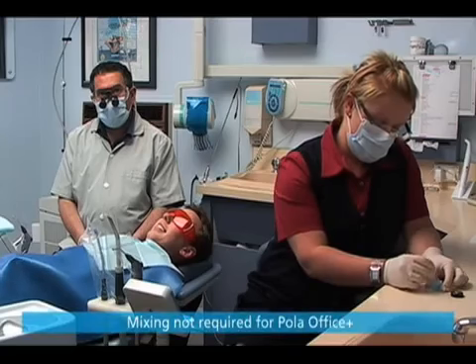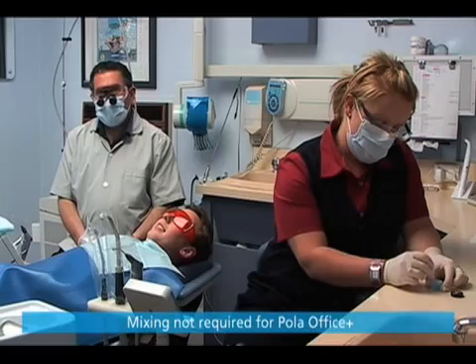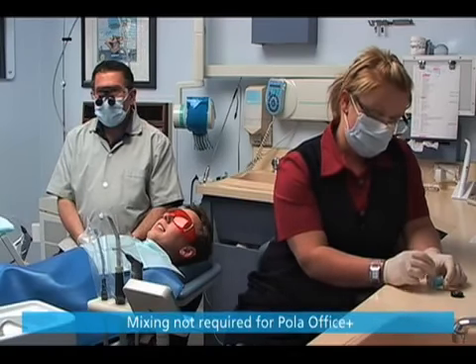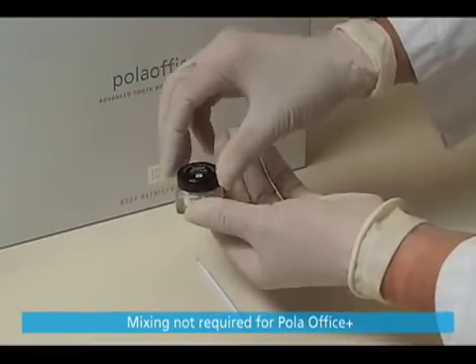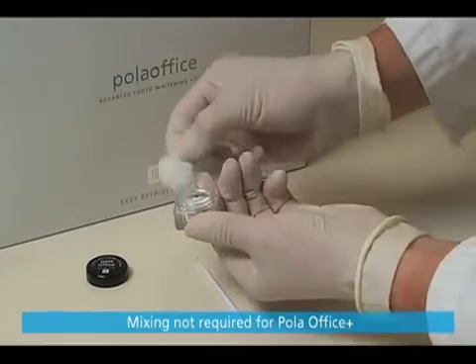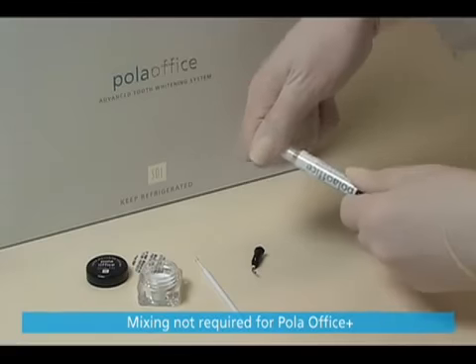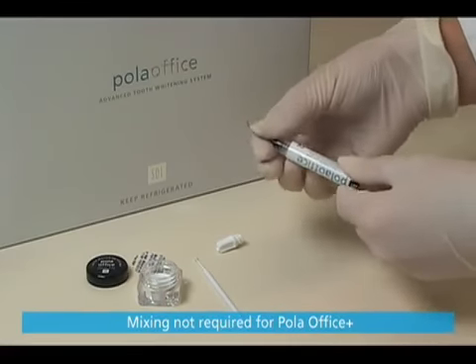Once mixed, Pola Office gel is effective for 20 minutes. Therefore, it is important that the liquid and powder are mixed just prior to being applied to the teeth, away from the patient. Have a timer ready. Open the powder pot. Take one Pola Office syringe and firmly attach a tip.